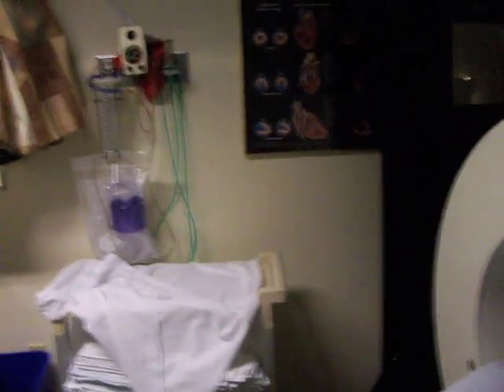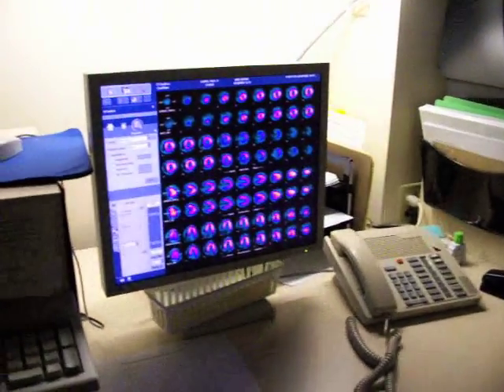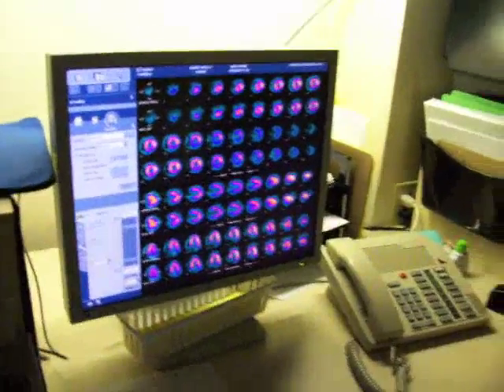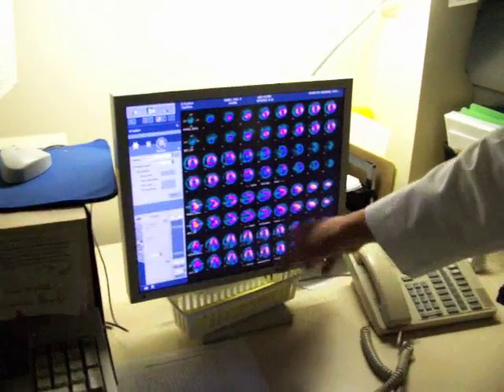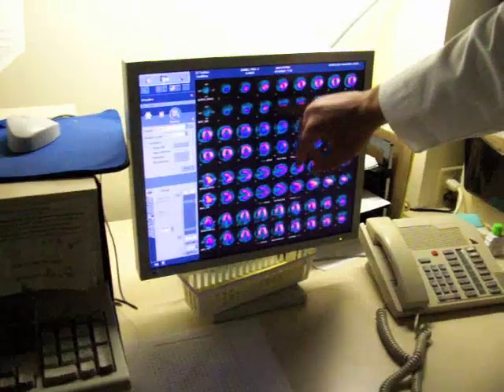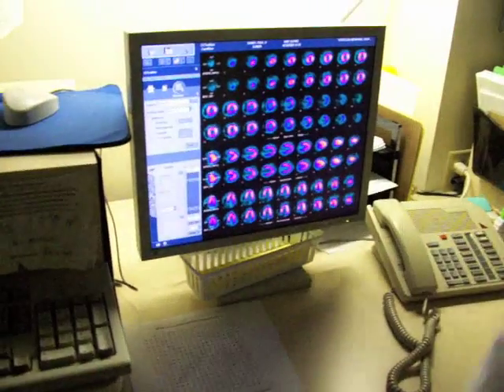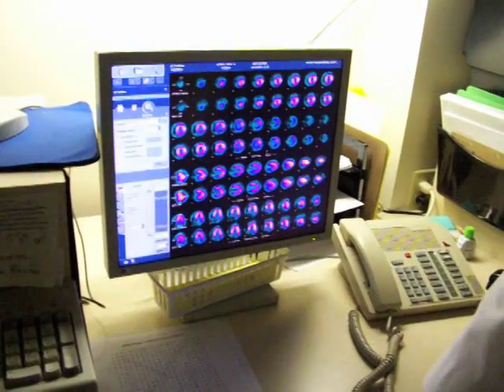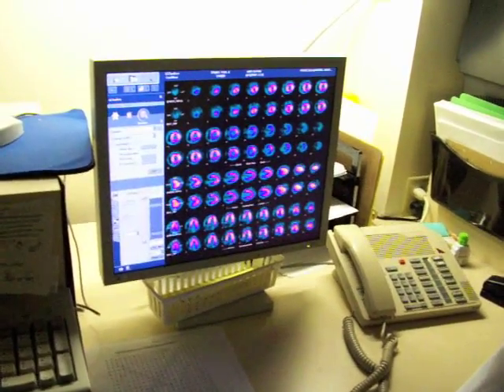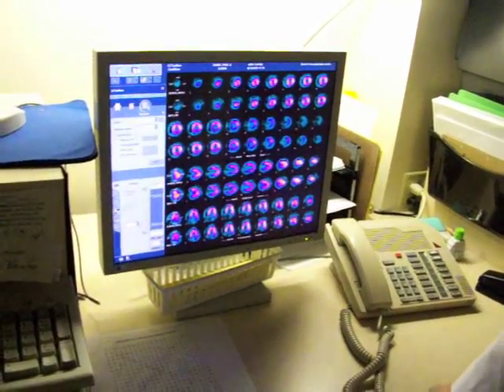You see my heart rate up there. 157. 157 right here after the treadmill, and now these are what they found, and Cody's going to explain what we're looking at right here. So I just started processing the images here, and these are the slices of Mr. Daniel's heart here in different projections, the left ventricle. The bottom one of each two is the rest, and the top line is the stress images, the more important ones. And what we're going to look for is any exercise-induced ischemic changes in the perfusion to the left ventricle, and we'll do some more processing and also calculate approximately how strong your heart's beating.